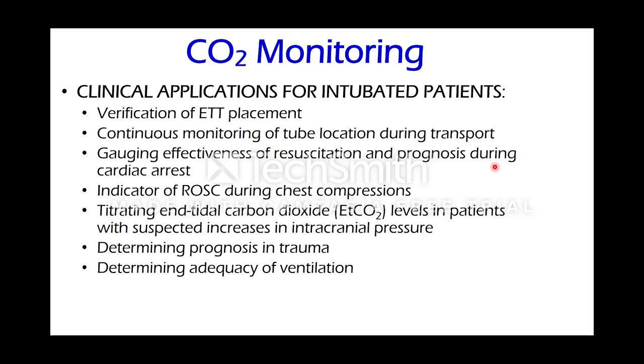Clinically, measurement of CO2 in the exhaled gas is very important. It can help us verify the ETT placement, continuously monitor correct intubation and resuscitation, especially during transport. It can tell me how effective my positive pressure ventilation is, and can tell me about the prognosis. If I have a normal capnography or a normal CO2, that means I'm ventilating, there is good circulation, and there is good ventilation. So it's very important in cardiac arrest. It's an indicator of return of spontaneous circulation, because without spontaneous circulation, even if you are ventilating, there will be no CO2. So to have CO2, we need good perfusion and good inhalation and exhalation.